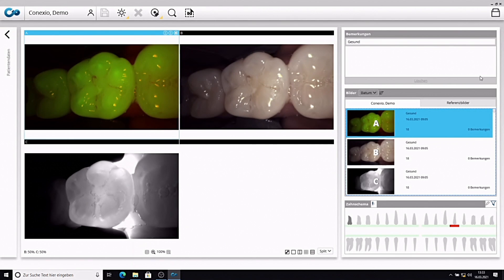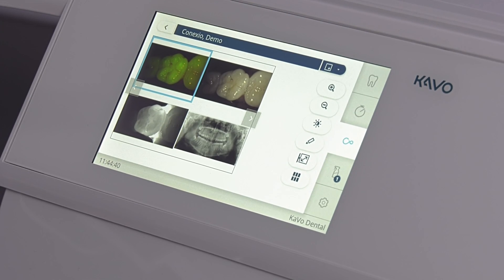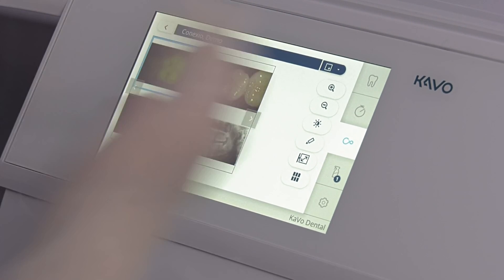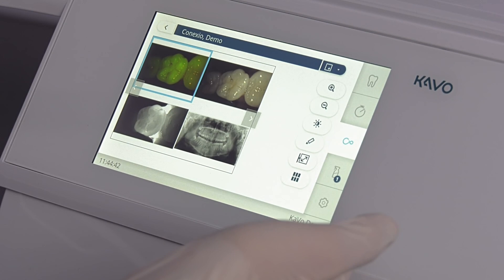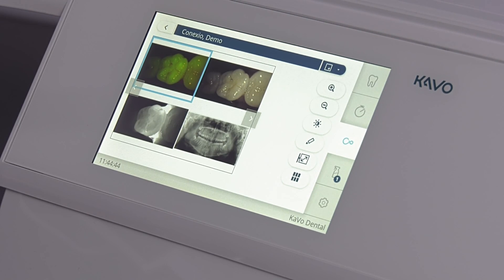Within this view, the images can be edited with various tools and teeth can be labelled. In addition, the clinical monitoring status can be determined and logged.